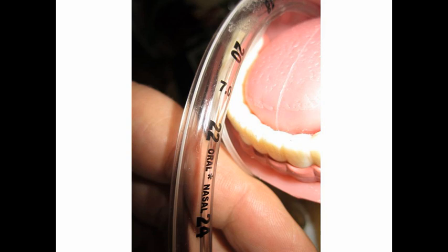Now, there are very tall women and there are very short men, so we use these approximations. When the 21 centimetre calibration reaches the lower incisor teeth in most females, and approximately 23 centimetres at the lower incisor teeth in most males, we should be at mid-tracheal point.